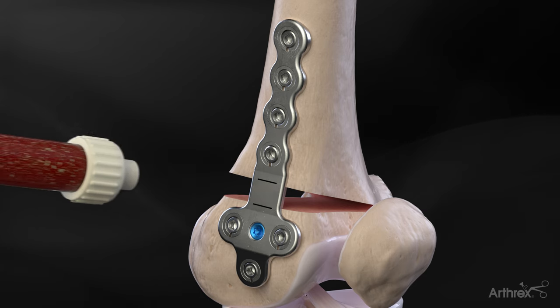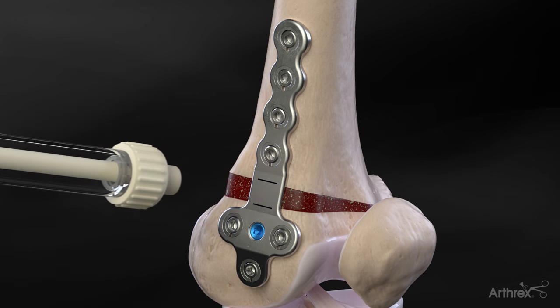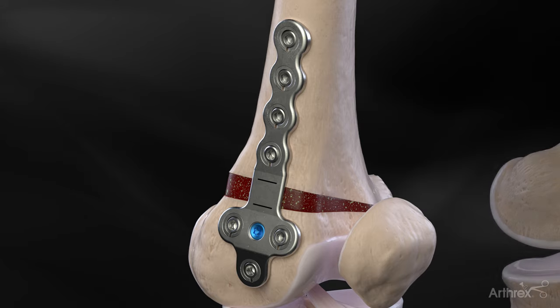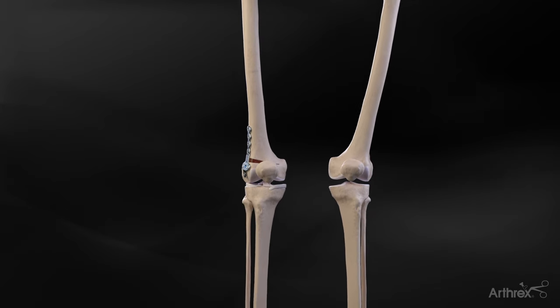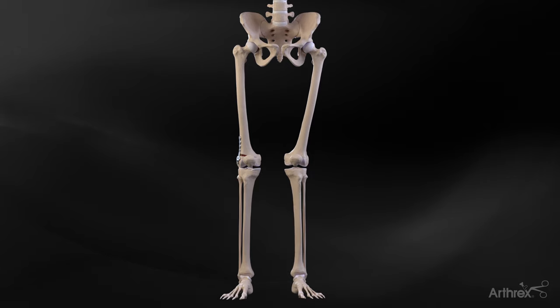Once the plate is secure, Allogene Pure Demineralized Bone Matrix, comprised of 100% human allograft bone, will help facilitate bone remodeling at the osteotomy site. Contour lock plates are available in titanium and stainless steel. Select the appropriate sized contour lock femoral osteotomy plate based on the left or right femur and amount of correction.